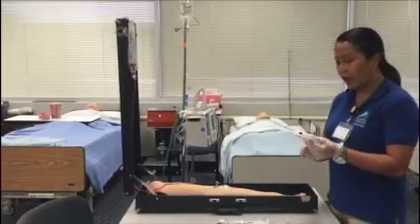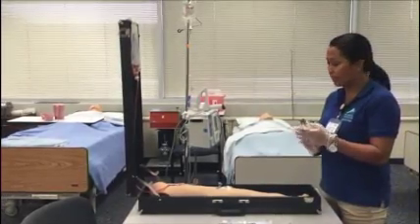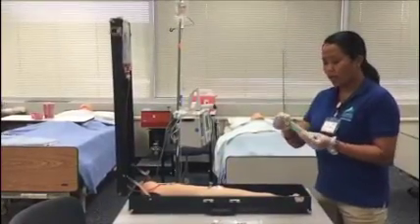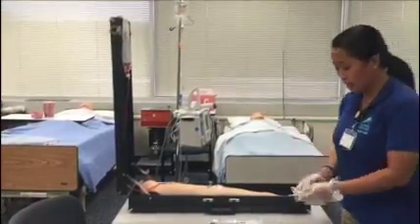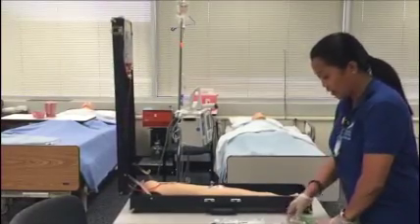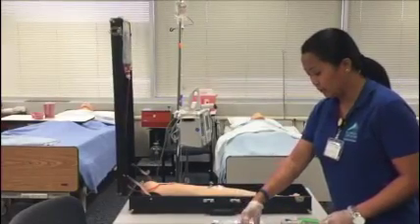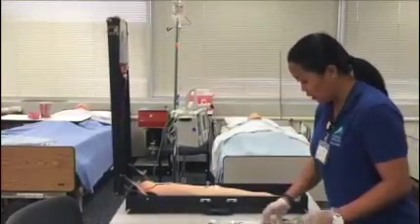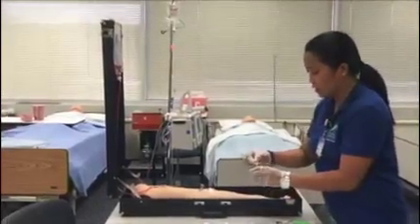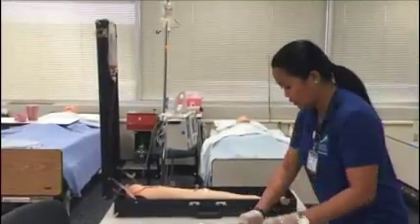Now I'm going to document on the IV bag the name of the patient, the date, the time that I'm giving it, and what kind of medicine I mixed in it. I tape the documentation behind the IV bag, and then I'm going to clean the medication container. I'm scrubbing it, and this is clean.